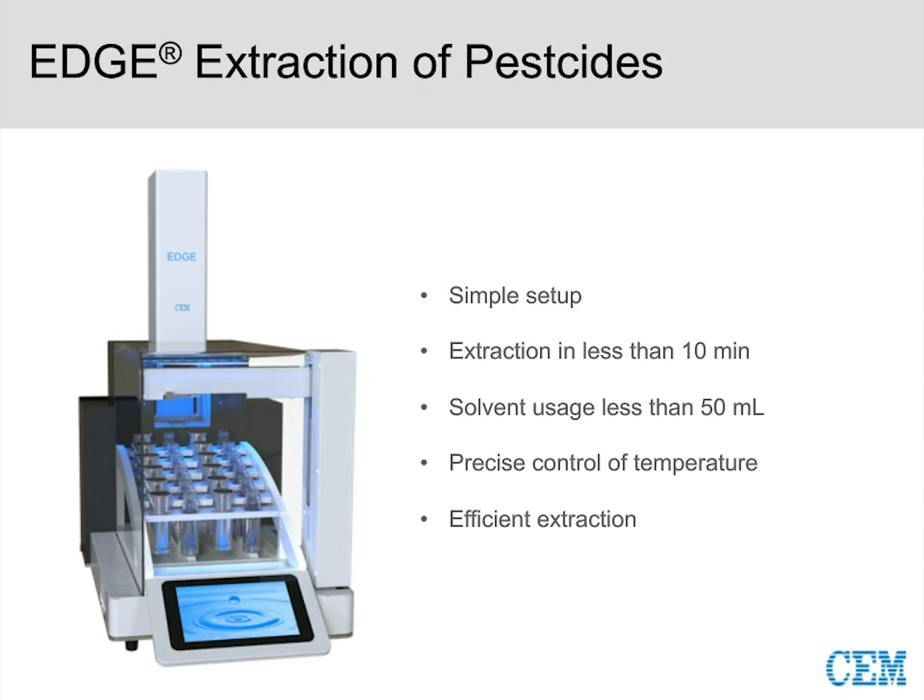I will note that this is solvent extraction. So we are using, including washing, around 50 mils of solvent. And I recognize that that is more solvent than the QuEChERS method. However, it is significantly less solvent than other techniques we might be comparing to. And later on in the presentation, I'll address that extra solvent and how we deal with that.